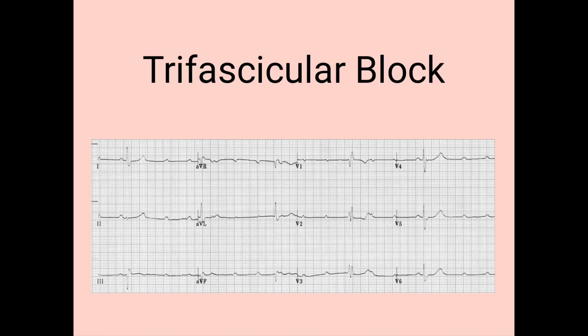Hi friends, in this topic of ECG Basics, today I will talk about Trifascicular Block.